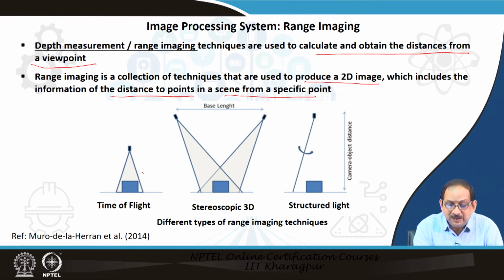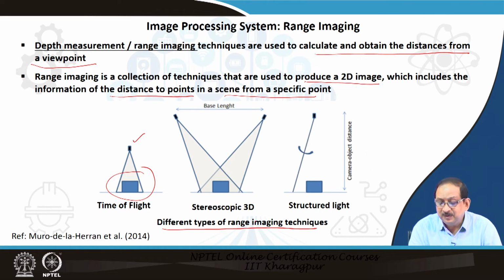As you can see, it actually measures the distance from a viewpoint by using different types of methods like time of flight, stereoscopic 3D system, or structured light system.